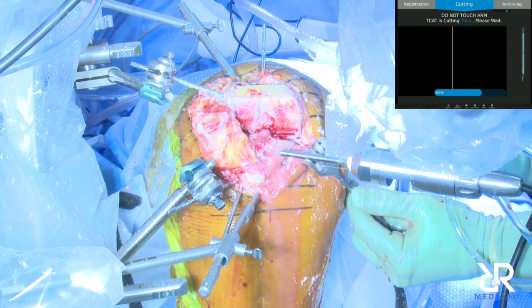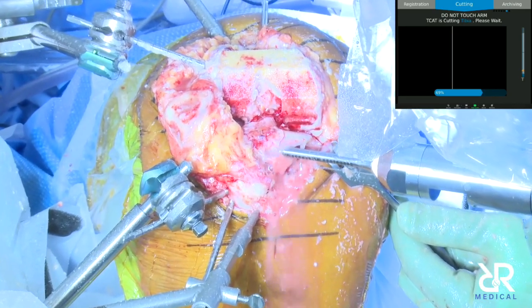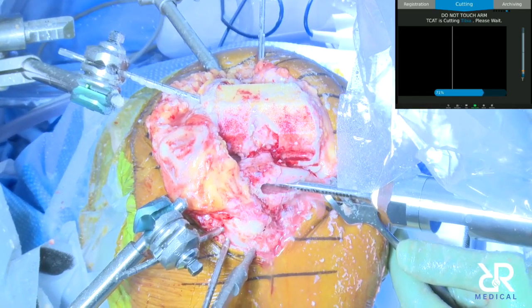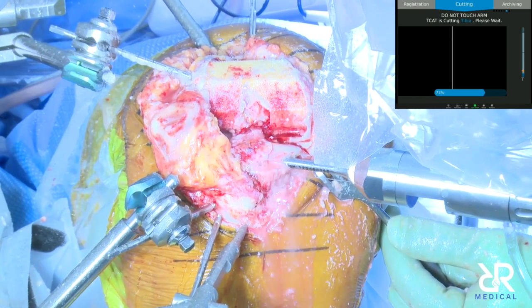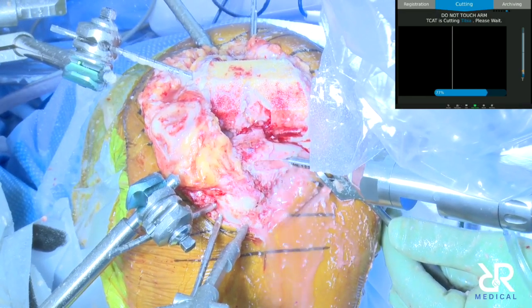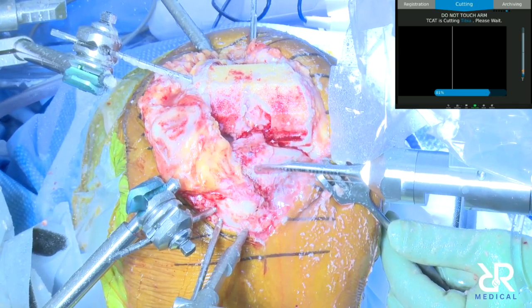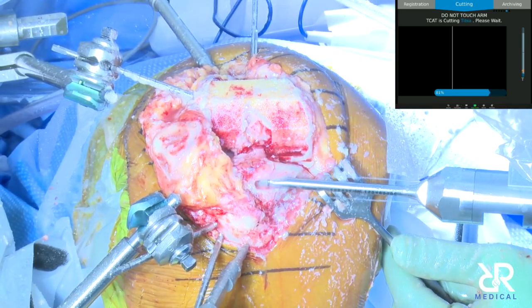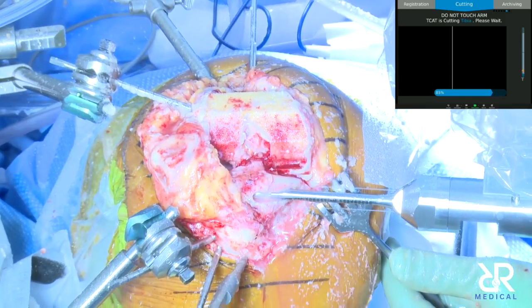It was always my thought that the reason why we're having to balance is we're making bad cuts. And if you make good cuts, you don't have to balance. Well, you know, Mako's not accurate. They don't have any accuracy data.